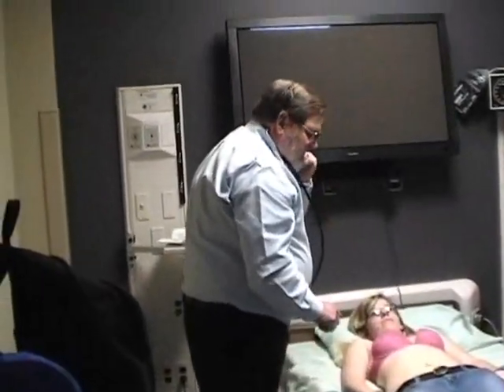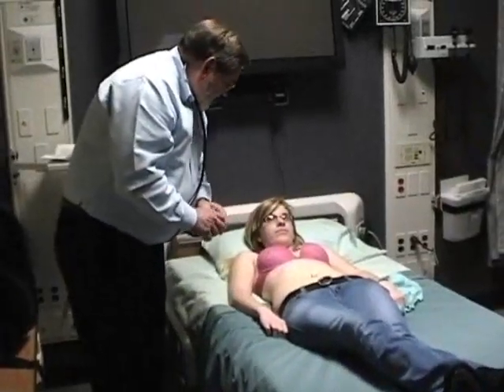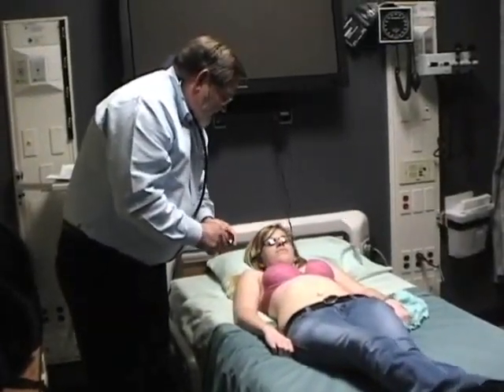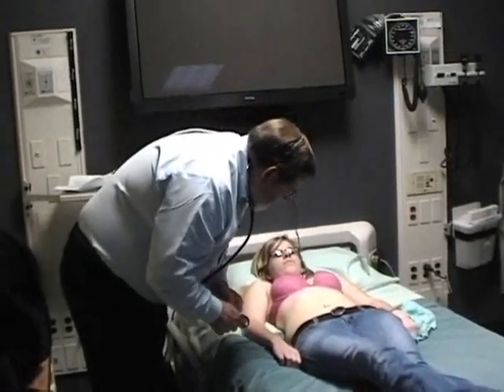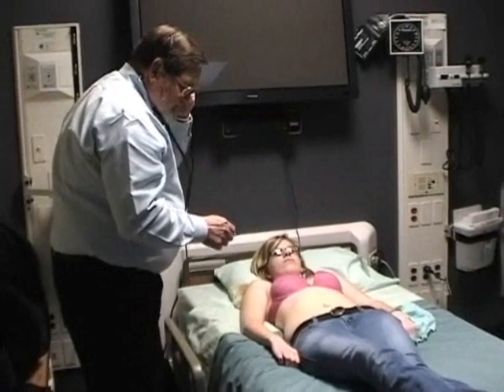So I'm going to auscultate. I do have a navel piercing. How long has that been in there? 5 years. It looks well healed. There's no drainage, no redness. Okay. So I'm going to auscultate.